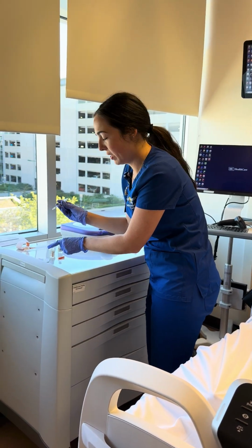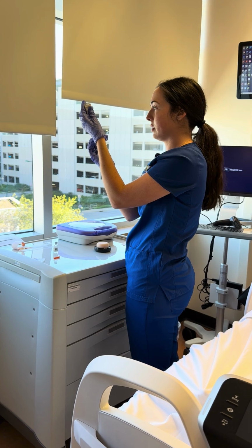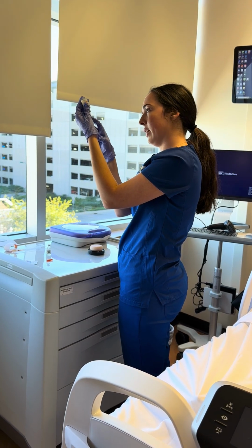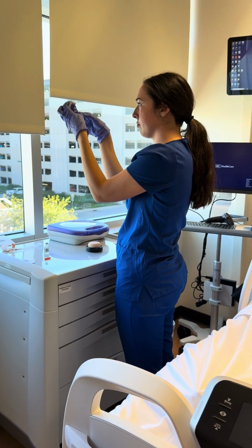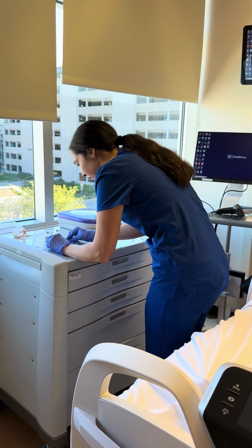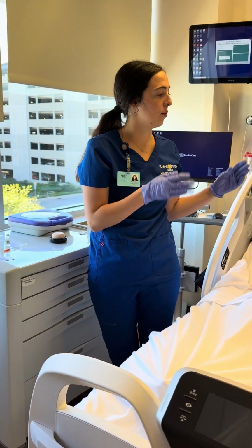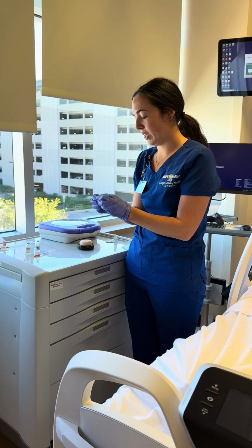So I'm going to go back into my NPH, which is my cloudy solution, and I'm going to draw up 17 units for a total of 24 units. Flick out any air bubbles. Alright, looks good. And I'm going to go ahead and cap my needle, just because it is unused for right now. So the next thing I'm going to do is notify my patient of our third med check. So I'm going to be talking with the patient about the medication that we're going to be giving her today. And then we're going to go ahead and get the area ready.